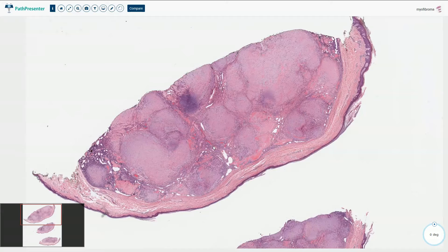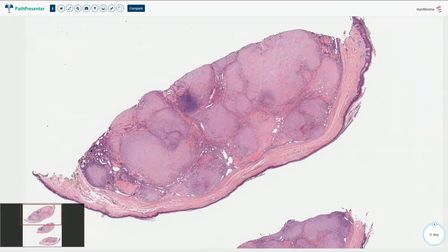Myofibroma is a benign neoplasm which occurs in small children and it is most common from birth to two years of age. It can be solitary or multicentric, in which case we call it myofibromatosis. The most common location is the subcutaneous tissue of the head and neck area, and here we see an example of myofibroma localized in the dermis.